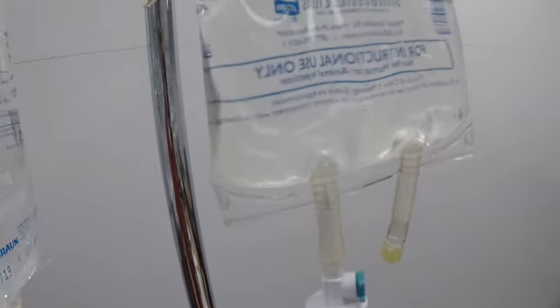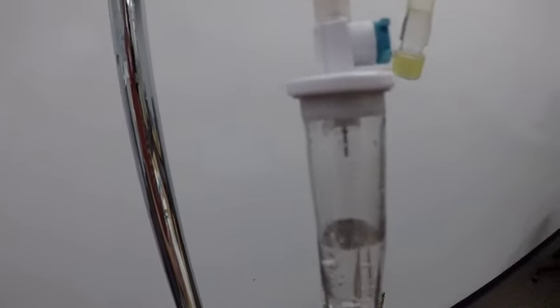Okay, so I'm going to go over to my micro drip set. Same type of clamp. And I am going to set up my medication infusion there, as I want to give 1 milliliter every minute. And I have to be so careful because it's a vasopressor that can be very caustic and can be harmful if I give it too fast or the wrong rate or not fast enough.